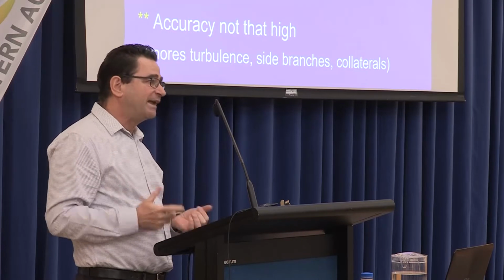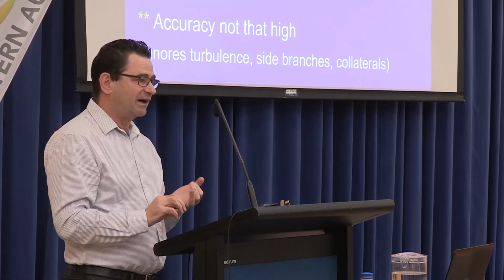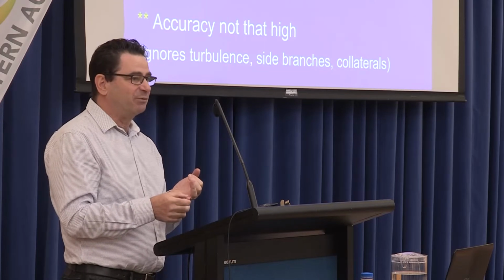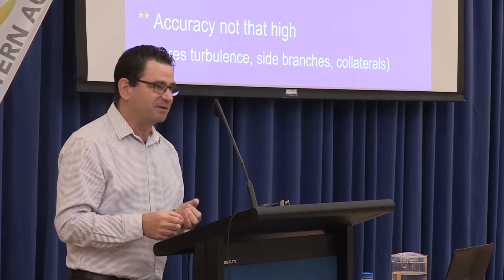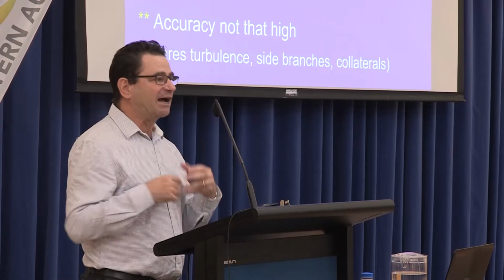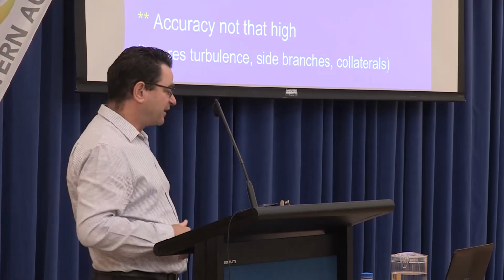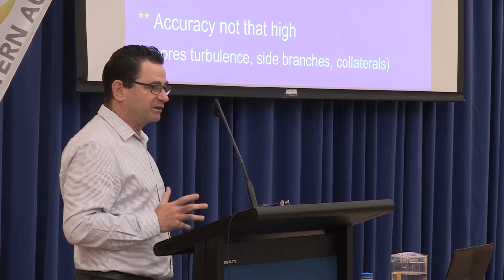So again, another point I wanted you to bear in mind is to be careful when people say there's a 55% stenosis or 63% stenosis. I just don't think Doppler's that accurate, to tell you the truth, and I'll come to how I reckon they should be reported in a second.